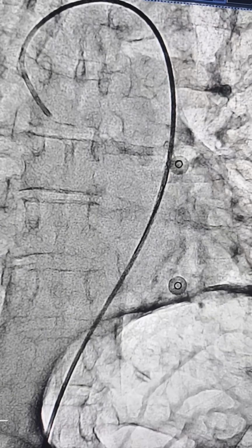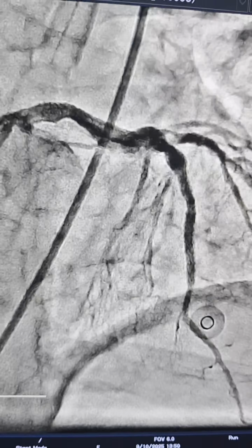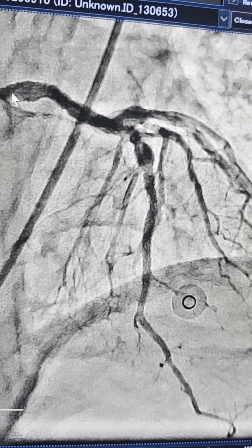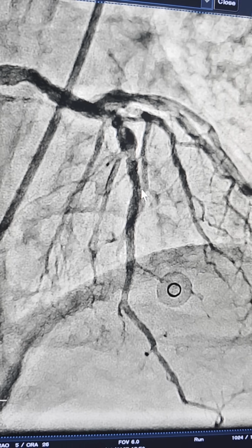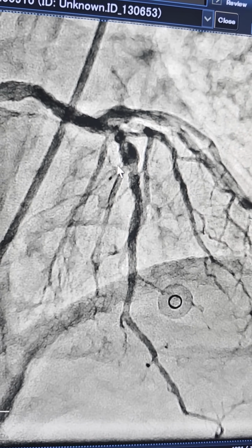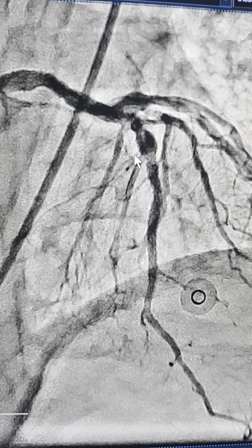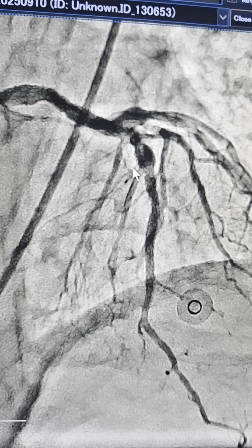So in any case, it's kind of a 1 in 1,000 case where I'm not sure what exactly happened. Maybe we abraded this area and caused thrombus here, maybe this ruptured, or maybe where we ballooned here there was some thrombosis and the backflow stopped, or whatever happened. But in any case, the patient was in full-blown cardiac arrest, and surprisingly we did an echo and his LV was perfectly fine, no wall motion abnormality.